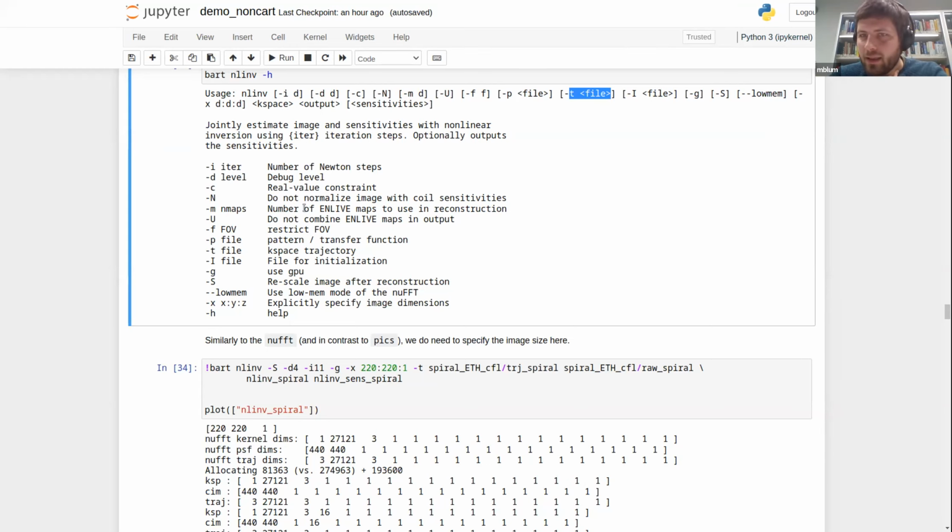Oh yeah, I skipped that question. Can you compare Pix without sensitivity map? Yeah, I don't know. Giving it one sensitivity map, but yeah, John, you can maybe do that in chat, and I'm just going to continue.